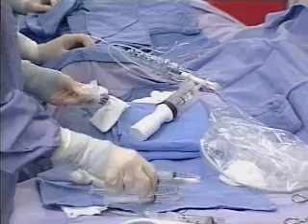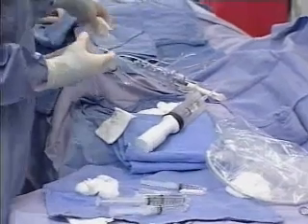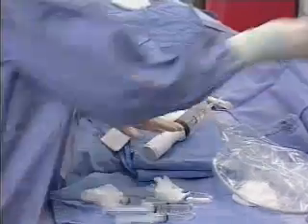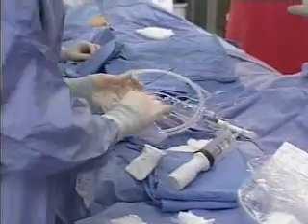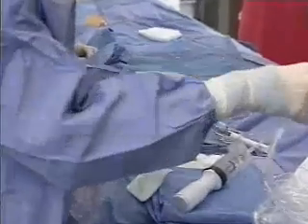So I think you're right, Mike. 28 millimeters looks like just the perfect length. These stents come in 13, 18, 23, 28, and 33 millimeters. And I think, as you point out, 28 millimeters is the closest match to the length that matches this fellow's blockage.